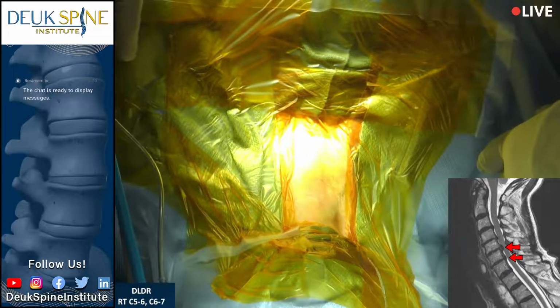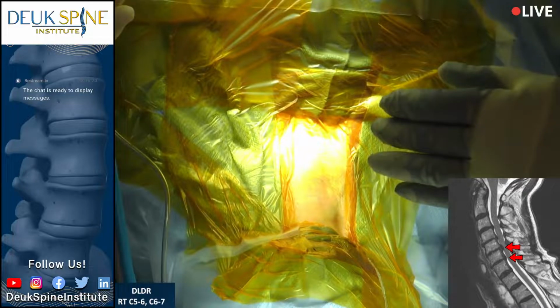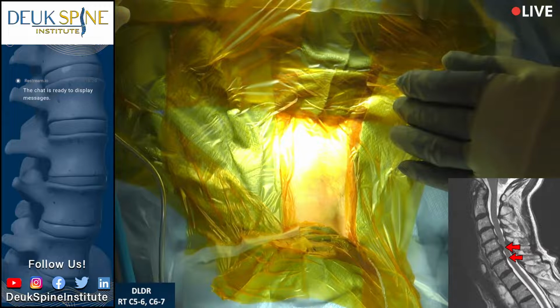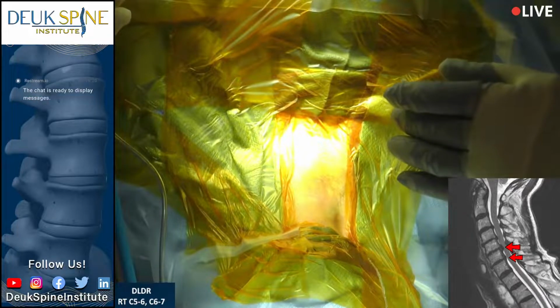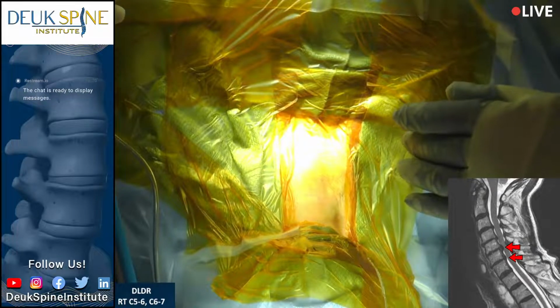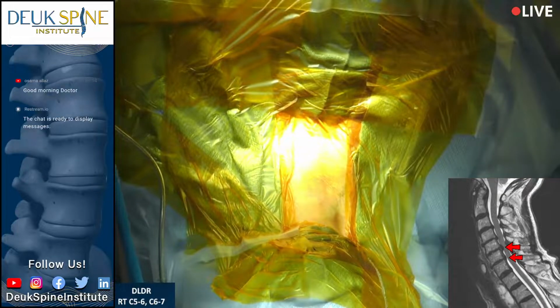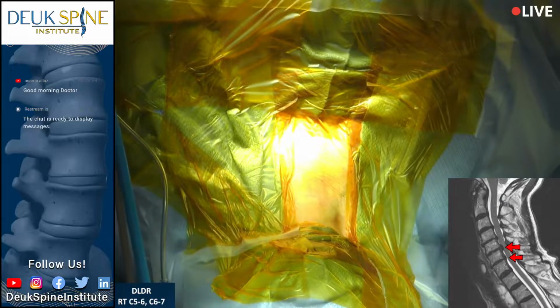All right, so if we look at the x-ray from the side view, and we'll be using an x-ray machine in the operating room called the fluoroscope, 2, 3, 4, 5, 6, 7. So you could actually move up a little bit because you're overexposed because you're penetrating the shoulders. You don't need to be. We're going to move our fluoro north about 1 inch. Shot. That's good. And Flynn, make sure you flip over to the x-ray picture so the audience can see.